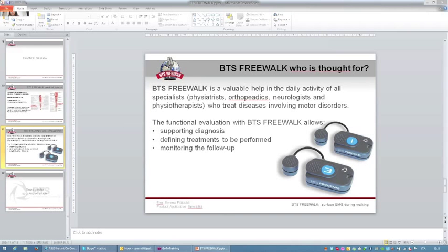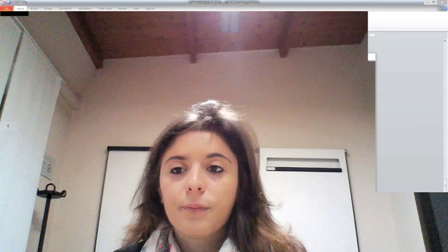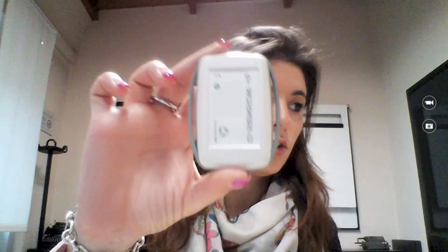Okay, so here is the sensor, the one that you already all know. I don't know if you have already seen the new one, which is this one. For the G-walk analysis, we are going to place this sensor on the belt in this position, with the connectors up and the label facing outside, right inside the belt, and closed in such a way that the sensor is not going to move on its own while we perform the analysis.